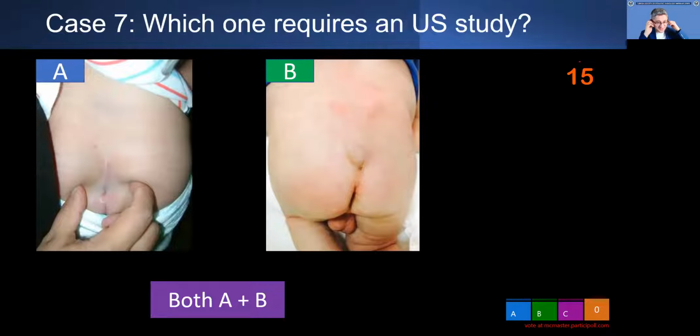Okay, so I'll start. That was a really good case because I've seen many times before people calling those lesions nodules, especially in the parotid gland as well. When you're scanning, it can be really hard to differentiate from a real nodule, right?